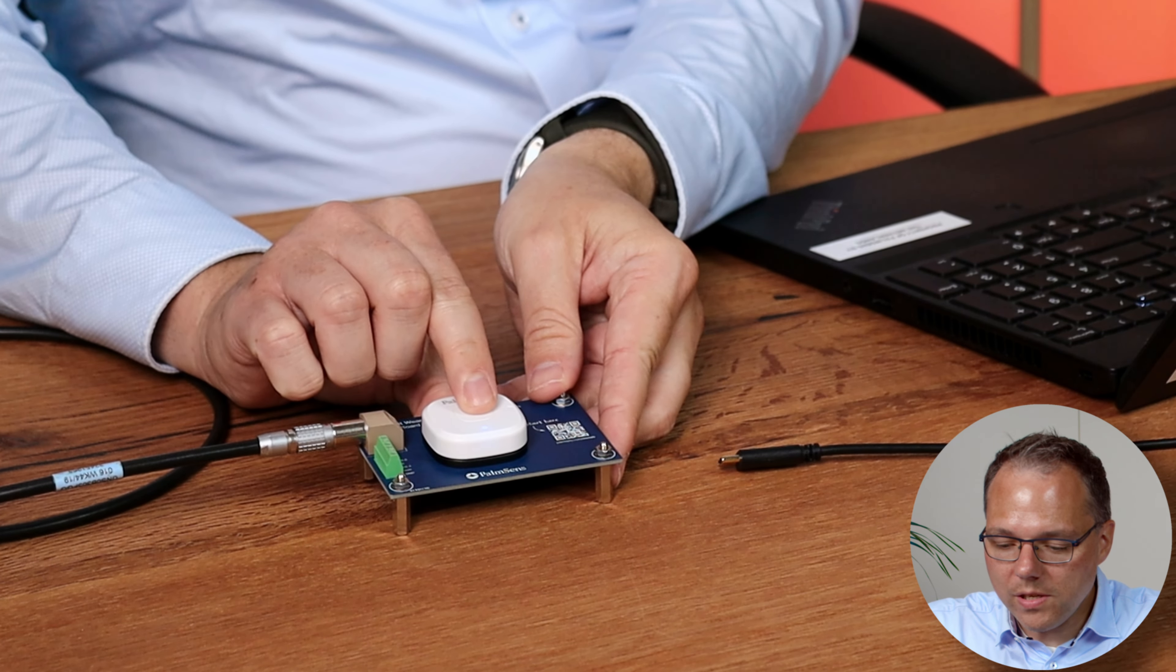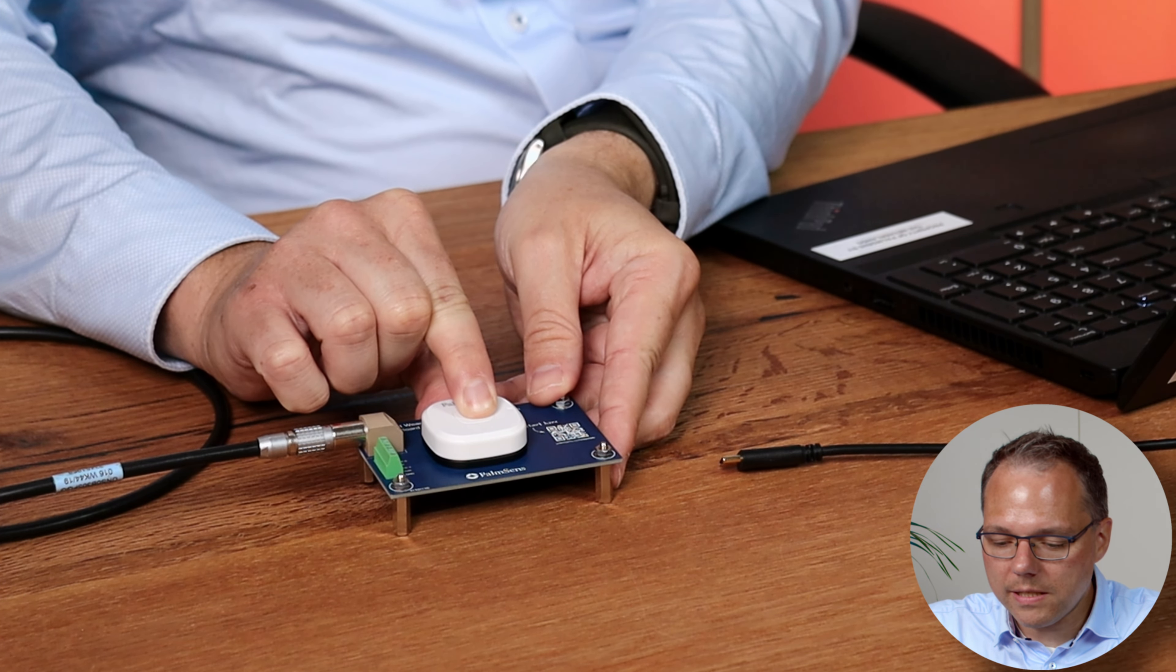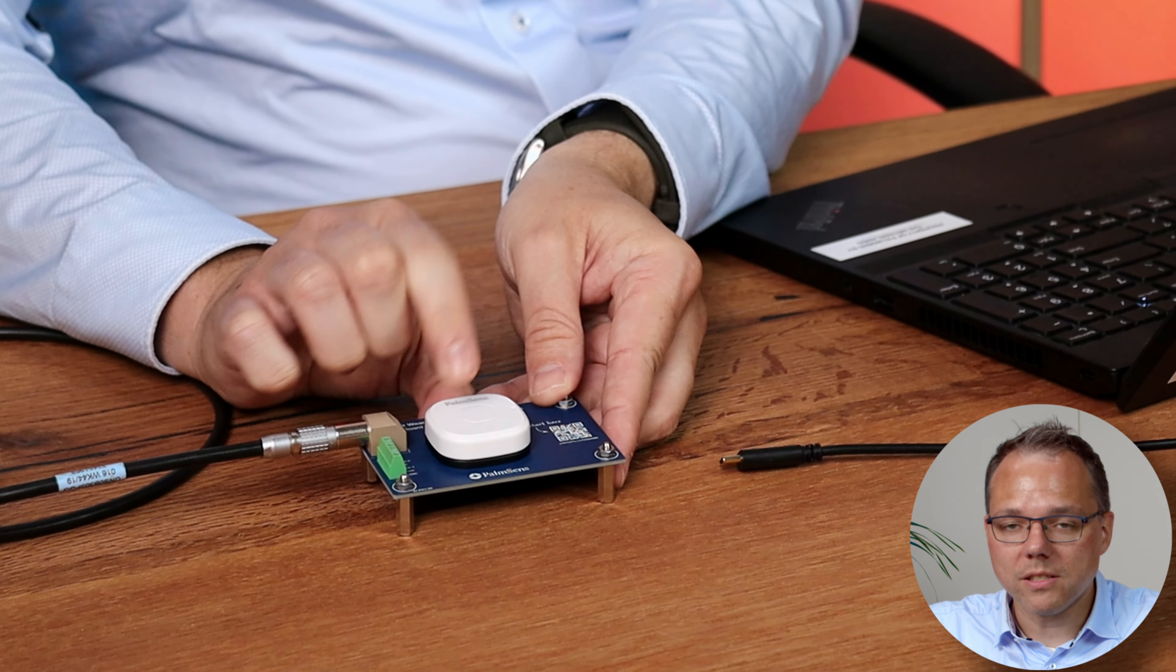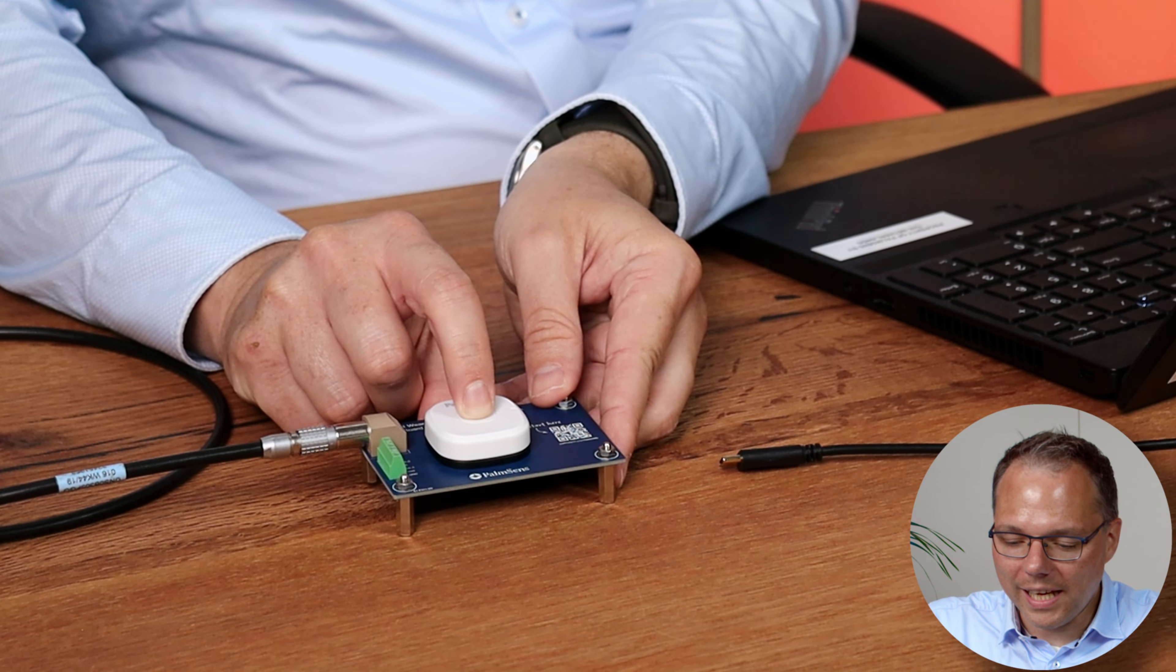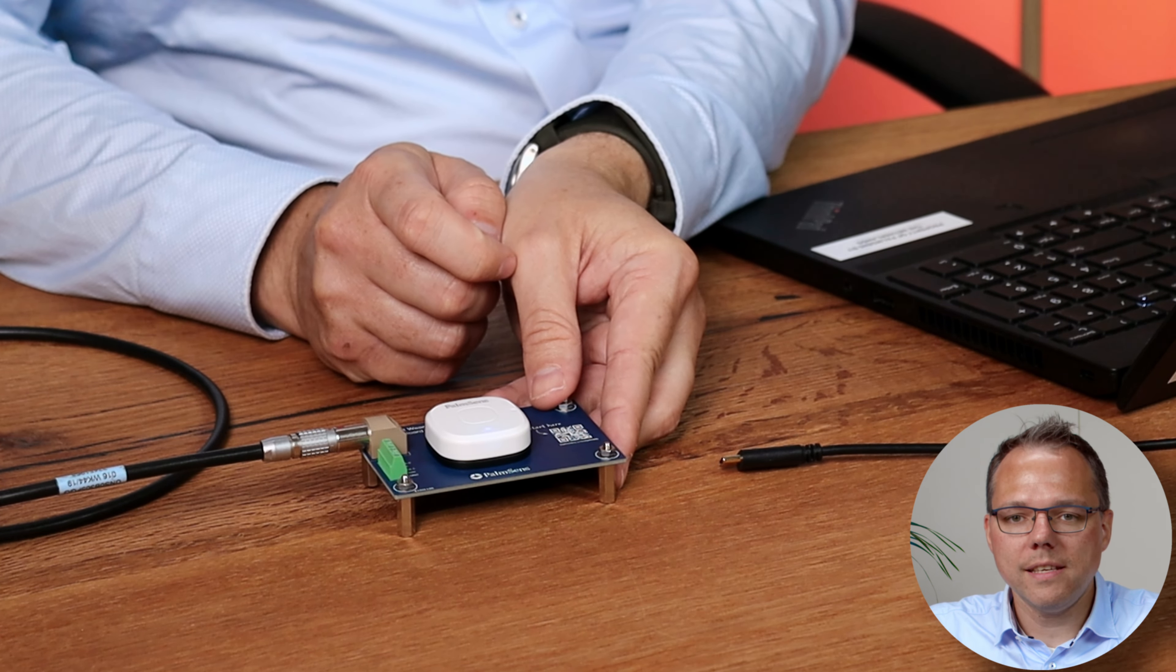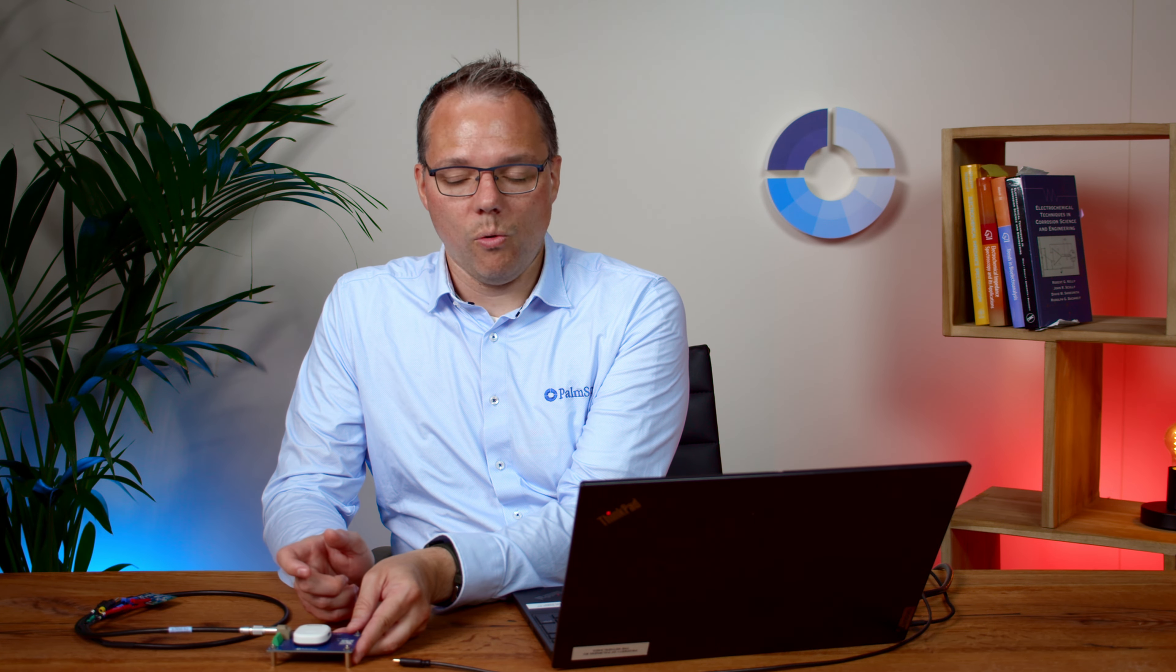Now I first switch it off for that I have to hold the button a bit and the blue light is off now I know it is switched off. Now I just press the button again the Sensit wearable switches on and I see the blue light is steady. That indicates the Sensit wearable is measuring right now.